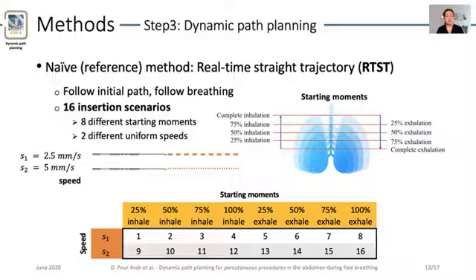The result of this method being dependent on the moment of the breathing cycle at which the insertion is started and on the insertion speed, we decided to examine 16 different insertion scenarios that combine 8 different starting moments with 2 different speeds, as illustrated here.